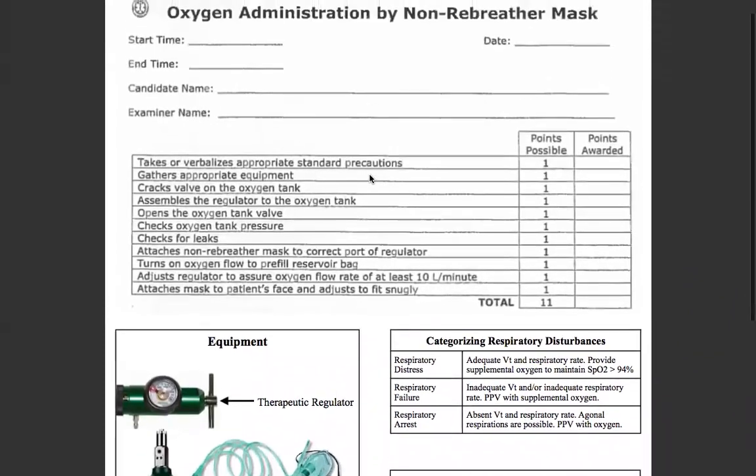We're going to verbalize standard precautions and make sure that the scene is safe — that's always number one at the top of your skills. Then we're going to gather the appropriate equipment. We'll talk about that in a moment. You're going to crack the valve on the oxygen tank, ensuring that there's no debris blocking the port.